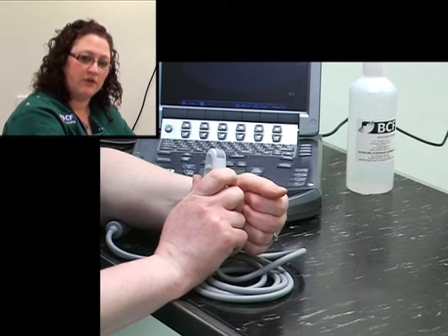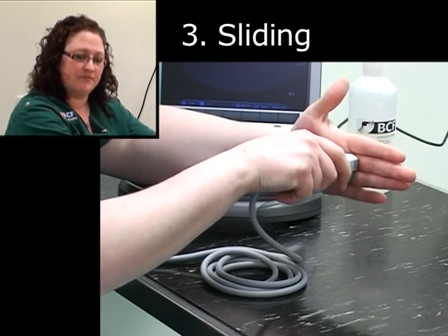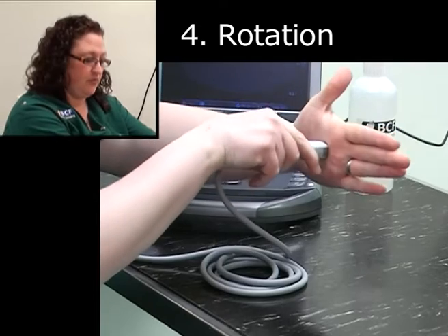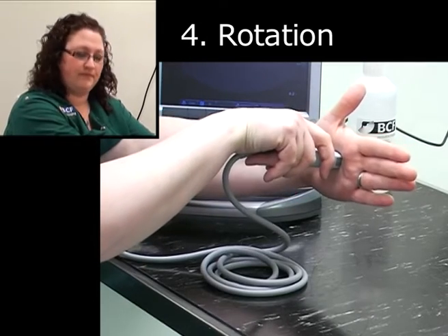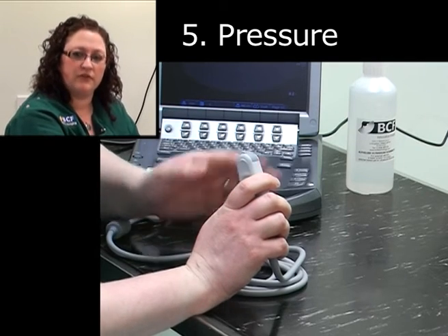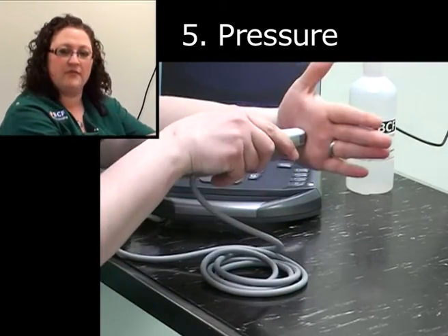A third movement is sliding, where the surface of the probe actually does move along the patient — exactly what it sounds like; you slide the probe in one direction. A fourth movement is rotation, placing the probe on the surface and rotating 90 degrees clockwise or anticlockwise. The last movement is pressure — either increasing or decreasing the amount of pressure applied — and it's very important to realize this is a movement because it makes a tremendous difference to the quality of your image throughout the abdominal ultrasound examination.